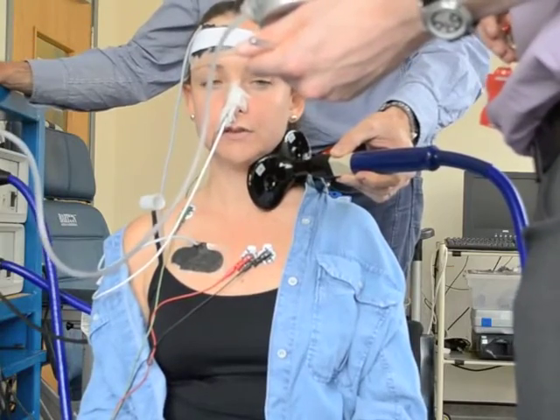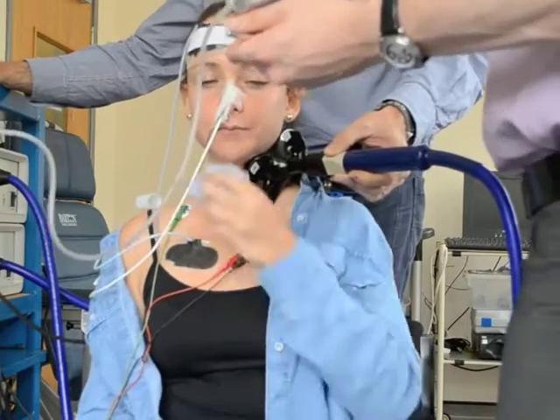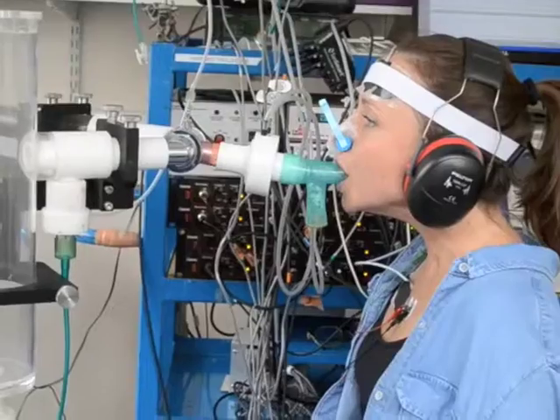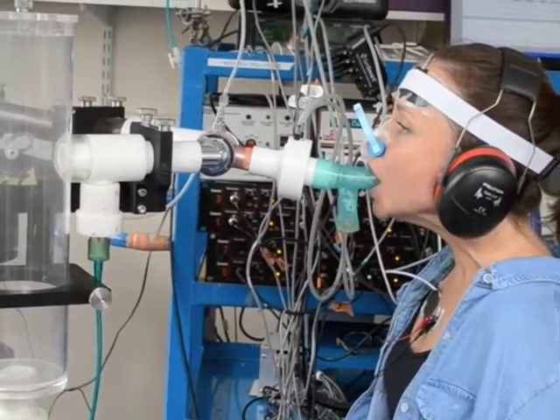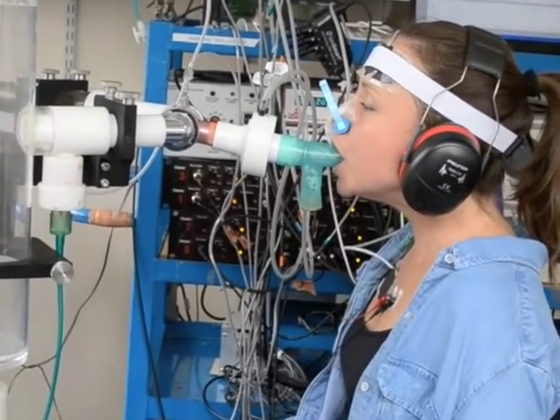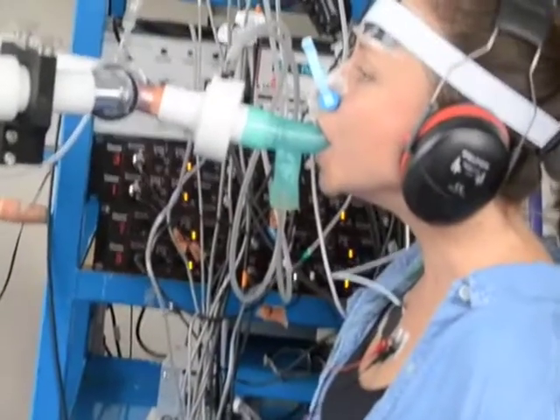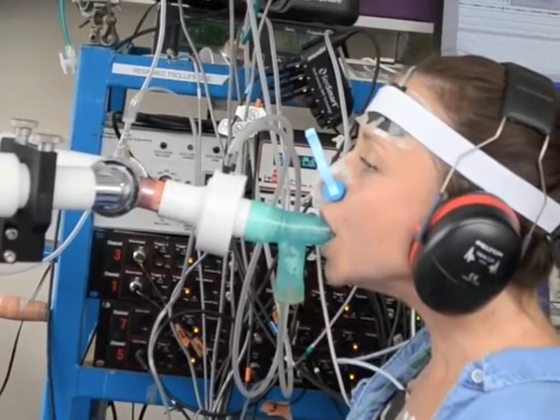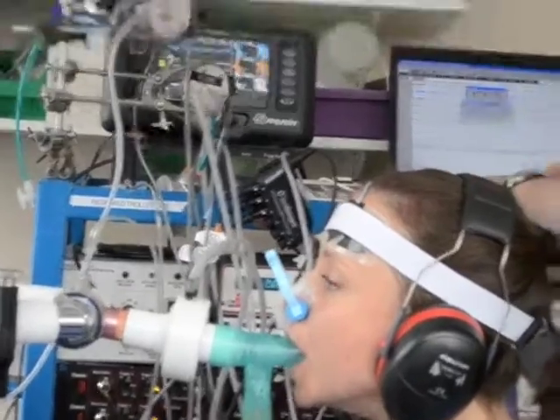The large clear chamber Monique is breathing into is attached to a vacuum cleaner in order to stimulate the breathing muscles. This is sort of like weight lifting for the breathing muscles, as when we breathe normally you have to lower the pressure in your chest so that air will move into the lungs. If the space from which you are trying to breathe in is already at negative pressure, your breathing muscles have to generate a lot of force to drop the pressure in your lungs before air will move into them.